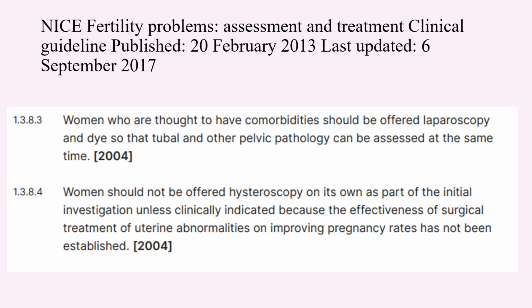So the question now is, what is the guidance provided by the National Institute for Health and Clinical Excellence, UK, for this procedure. For low and middle income countries where patients have to pay out of their pocket for medical expenses, patients may not easily be able to afford laparoscopy as a first line of investigation. And the NICE fertility guidelines also have this recommendation. They recommend that women who are thought to have comorbidities should be offered laparoscopy and dye so that tubal and other pelvic pathology can be assessed at the same time.